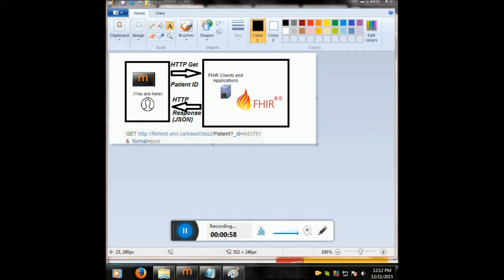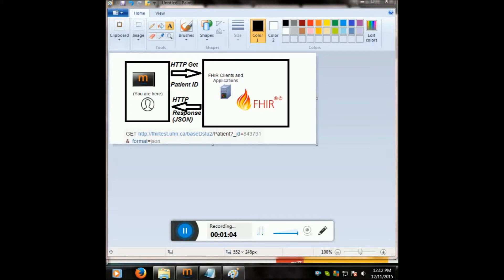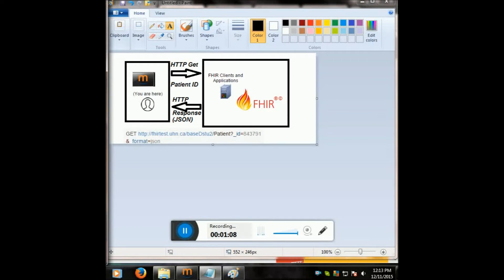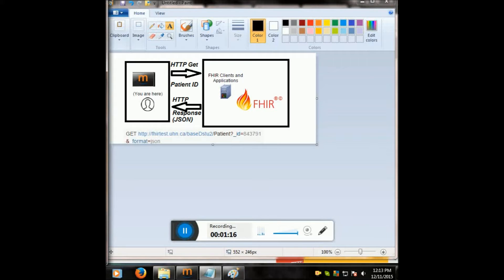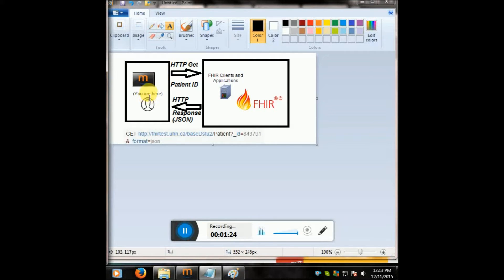What I'm going to do is a quick introduction on how to connect to a FHIR server and get a response back. My Mirth channel calls a GET request from a free online HAPI test server to retrieve patient information ID 843-791. You can see this little picture here, I tried to convey that.